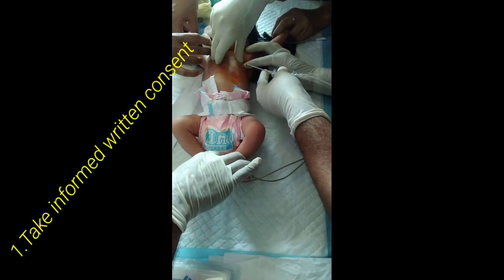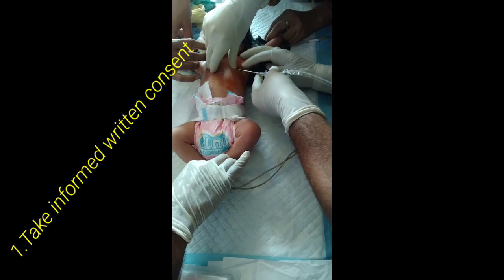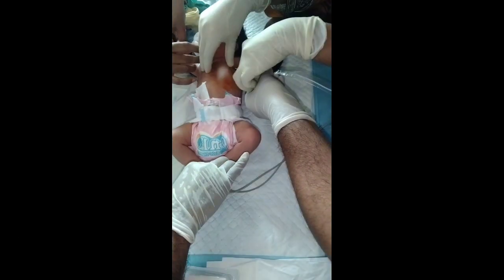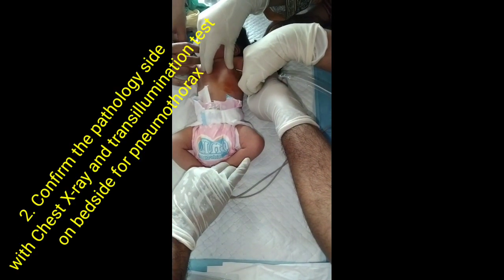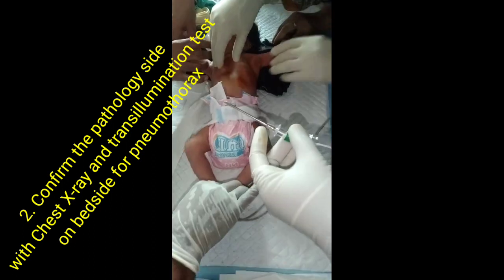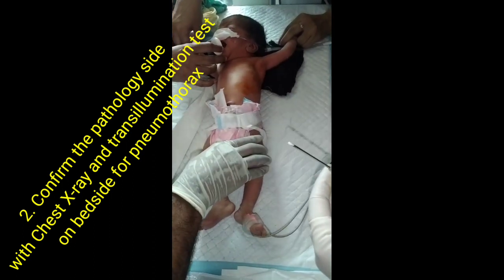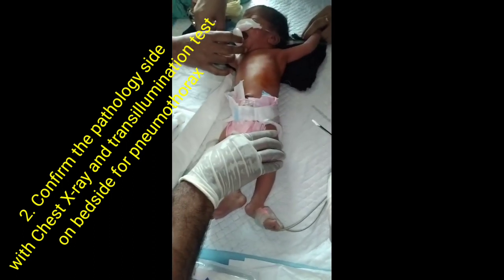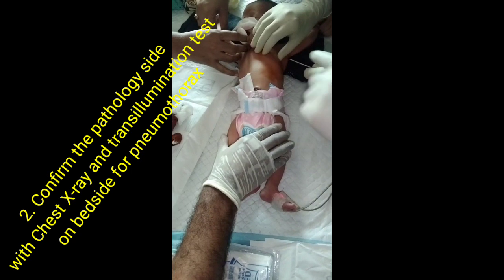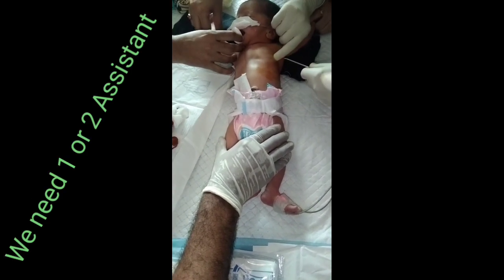Procedure. First step: take informed written consent. Second: confirm the pathology side with chest X-ray and transillumination test at bedside for pneumothorax. We need one or two assistants.